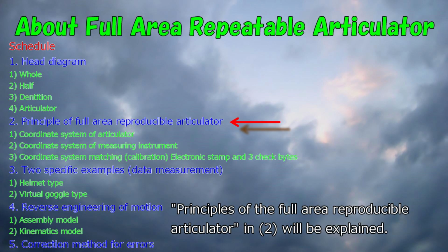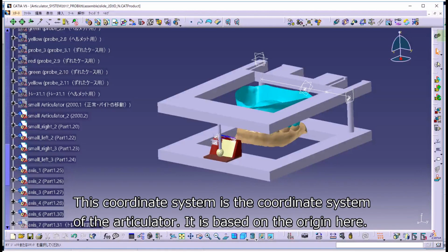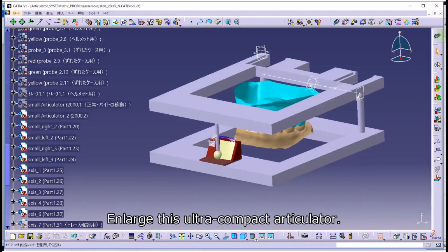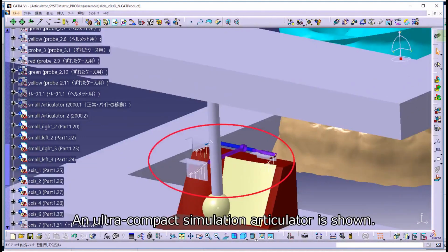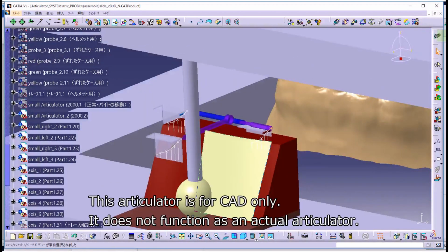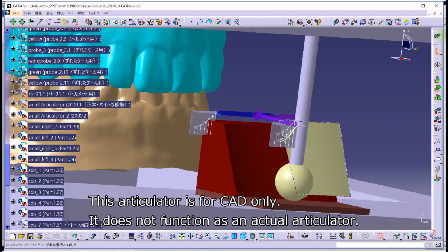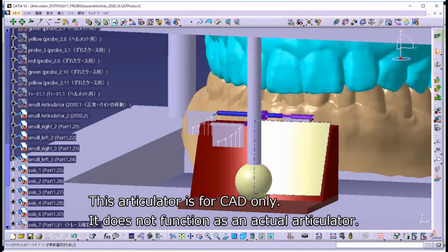Principles of the full area reproducible articulator, in 2, will be explained. This is the coordinate system of the articulator. It is based on the origin here. Enlarge this ultra-compact articulator. An ultra-compact simulation articulator is shown. This articulator is for CAD only. It does not function as an actual articulator.